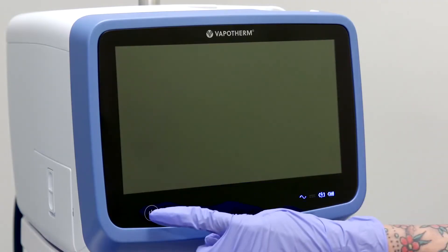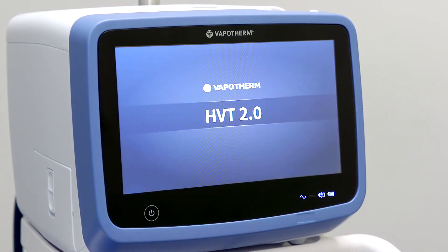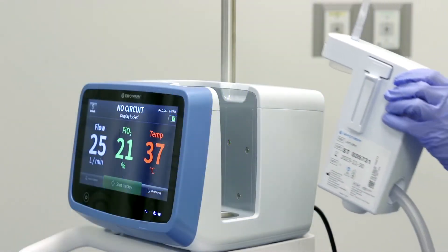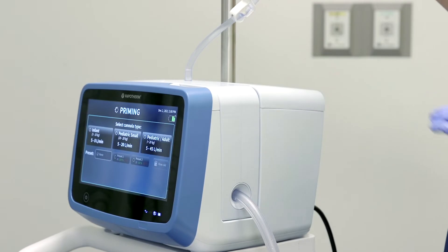Patient setup and therapy initiation requires just five steps. Step 1: Power the unit on. The screen will illuminate and display the message "No Circuit" at the top. Step 2: Insert the disposable patient circuit by sliding it into the docking nest. You will hear an audible click once it is fully installed and seated properly.